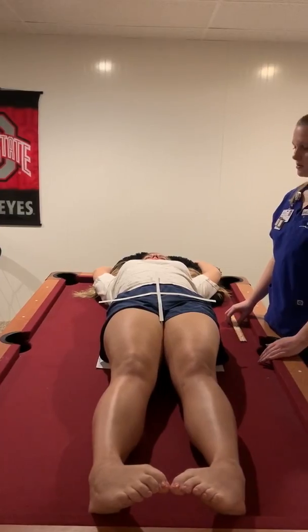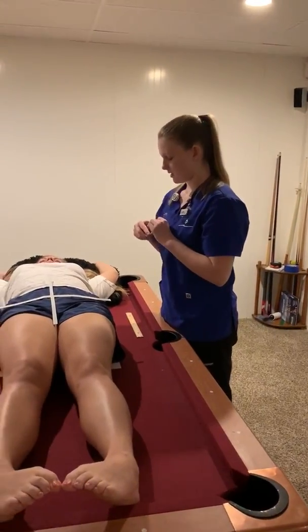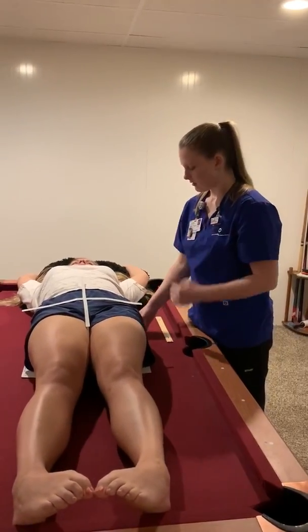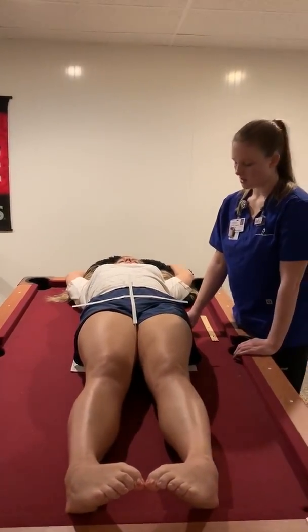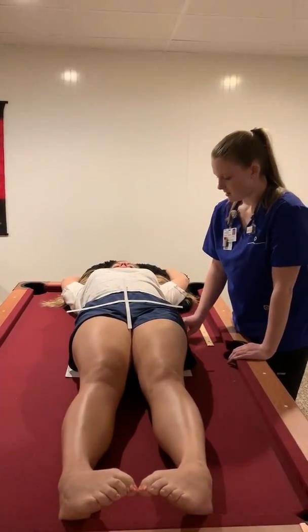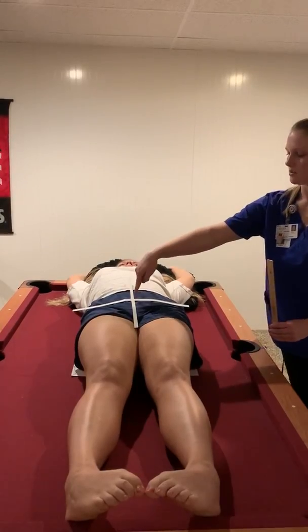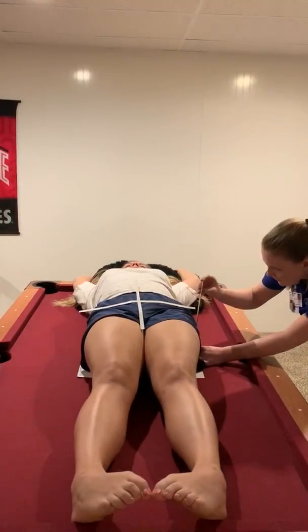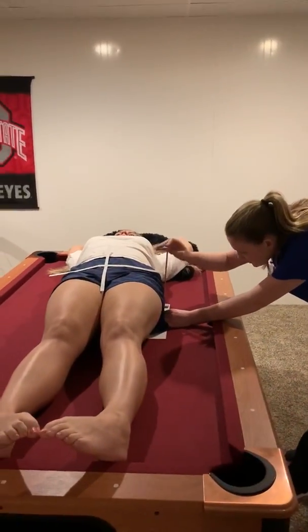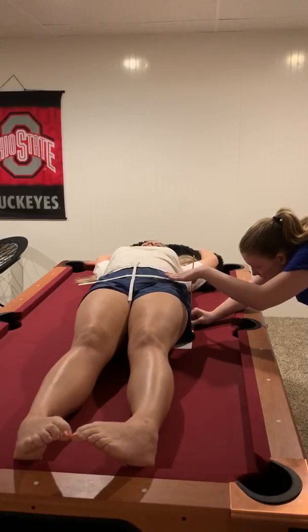So once I know everything's lined up and nothing's rotated, I'm going to put my left marker in the left upper corner of the patient's left side. And then I'm going to measure from where the central ray would enter through where it would exit. Since I don't have calipers, I'm just going to do my best here.